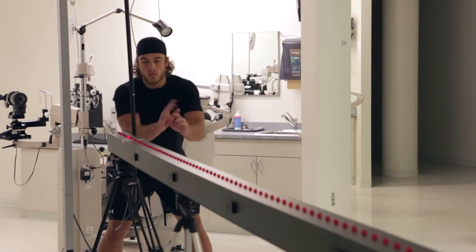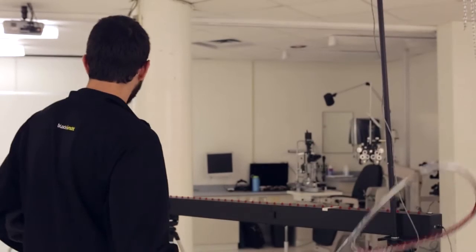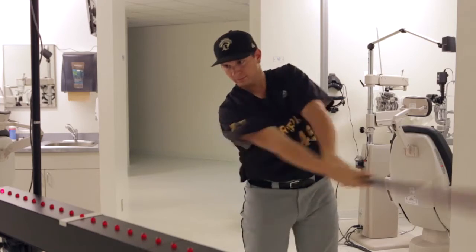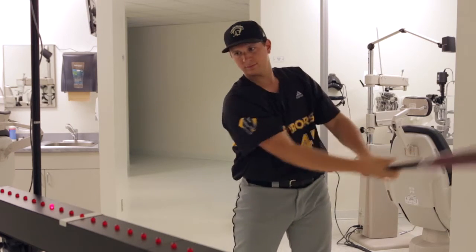We have what's called a BASS anticipation timer, which is a long track with lights that move along it. We use that to work with athletes on how they anticipate motion, whether it be a ball coming towards them or someone moving towards them, running towards them.